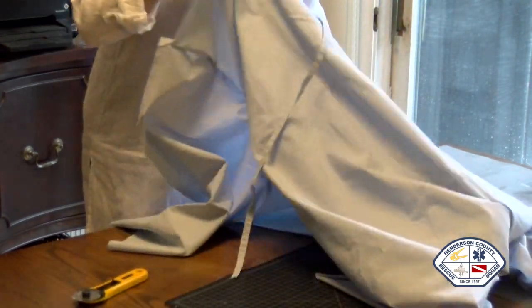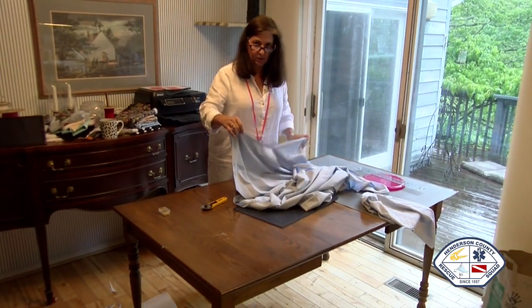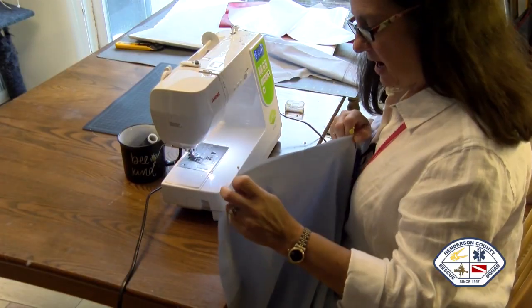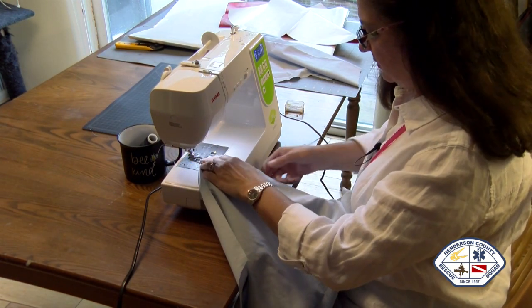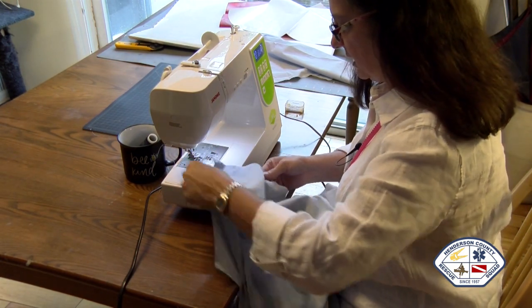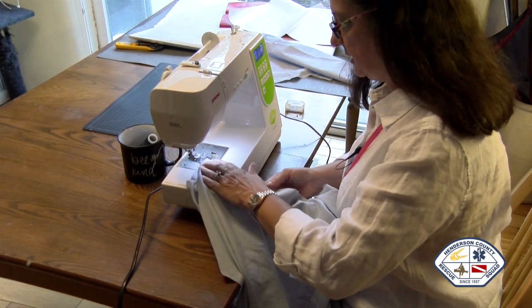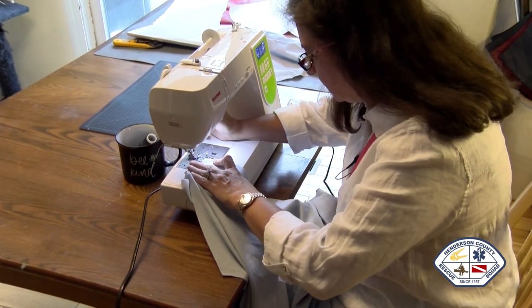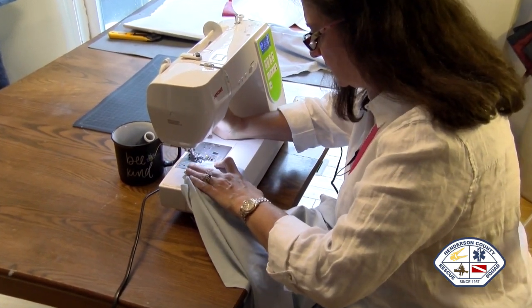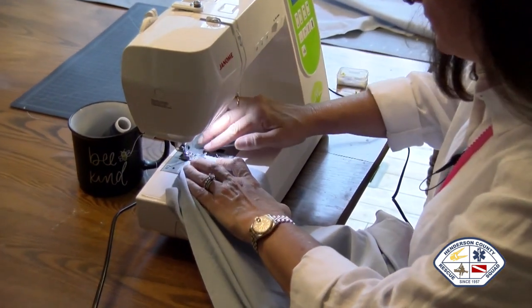So let's get my sewing machine out, and we'll see if we can make this look super great. Now, I've got my sleeve that's pinned in. I am using black thread on one side and white thread on the other side, primarily so you can see what I'm doing. I am using 3/8.